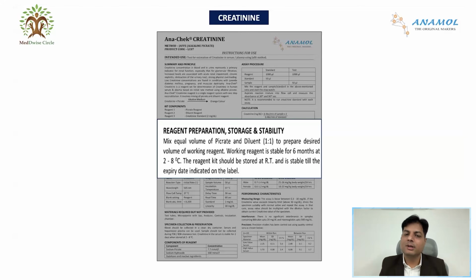Now, working solution may be readily given in the kit as a ready to use form, or it may not be ready to use. It may be in separate components. We have to mix these components and then only working solution will be ready. So this information needs to be understood before performing the test. This information is given in the reagent preparation section.